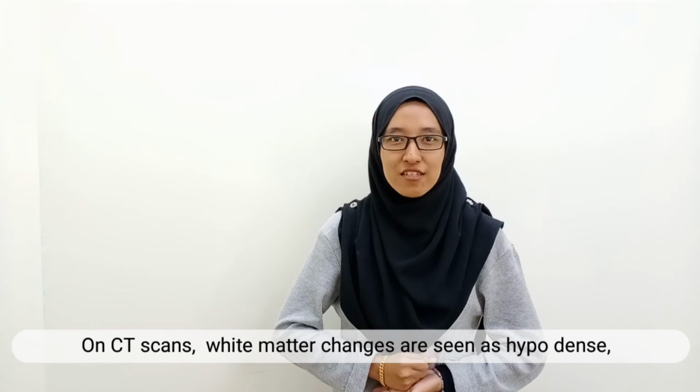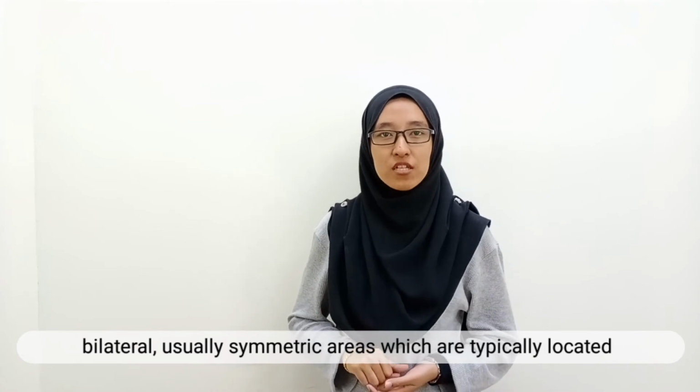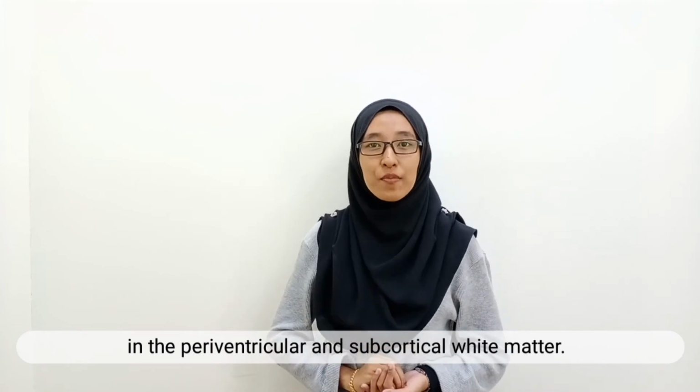On CT scans, white matter changes are seen as hypodense bilateral, usually symmetric areas which are typically located in the periventricular and subcortical white matter.